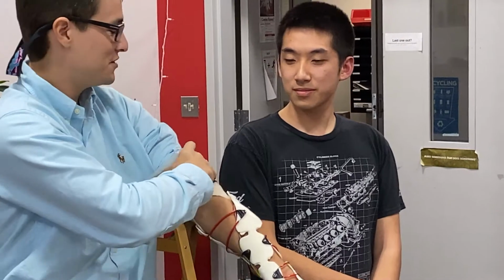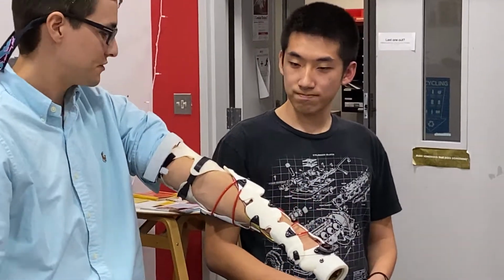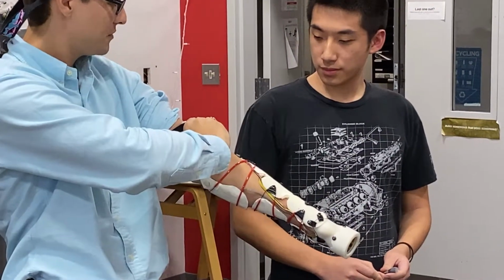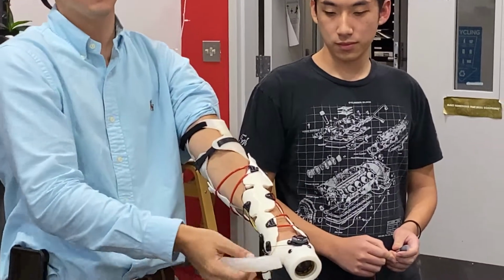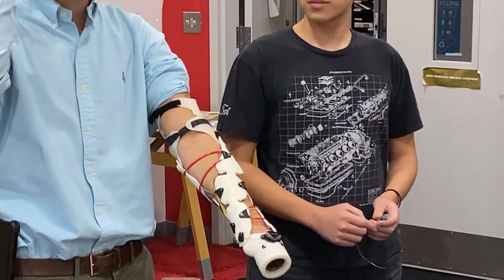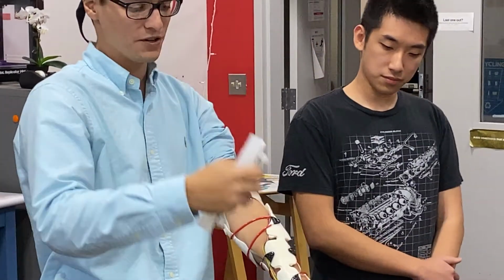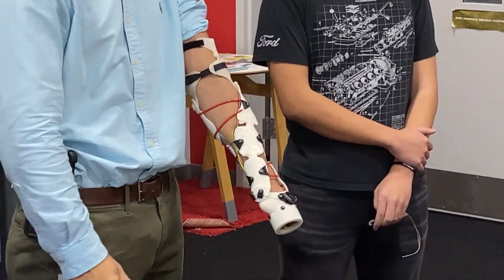So Marty's project this fall is going to be refitting it and coming up with the next version to fit with the arm. And I think your idea was to have it built in up here for one model, and then eventually having it actually in the appendage, so closer to those nerve groups that your body would recognize as touch in the arm and distal arm. We're going to try to put the feedback there so it's hitting the same potential spots.